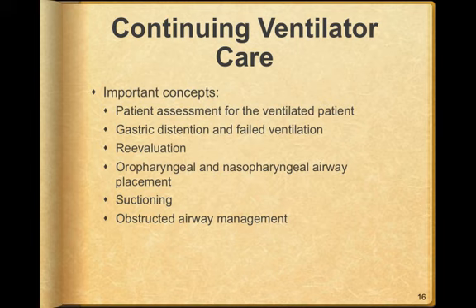Oropharyngeal and nasopharyngeal airway placement. Suctioning. Whenever we suction, be sure that the suction unit is ready. The purpose of suctioning is to minimize the risk of aspiration and to prevent it, if possible.